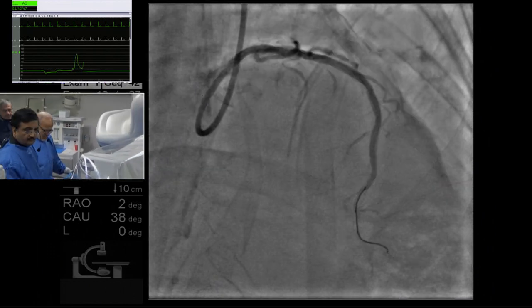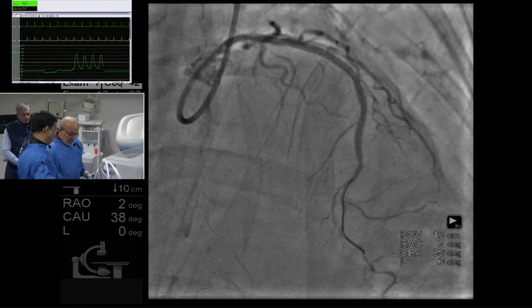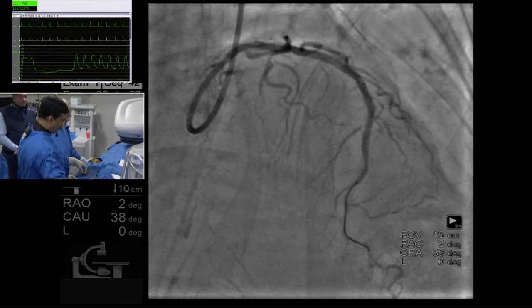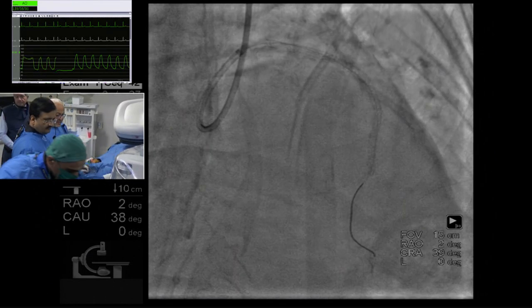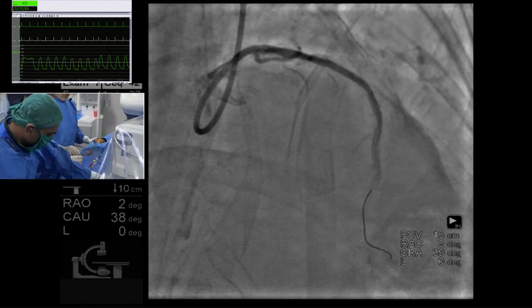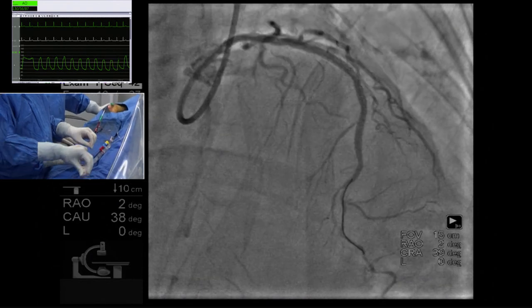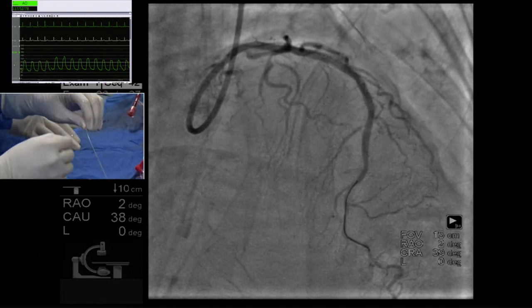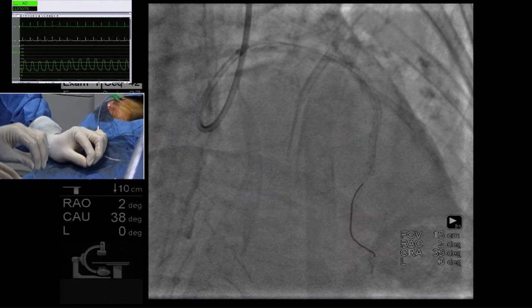Usually the side branch gets preserved. Yeah. In Miami, that's our default stand. I think Samir has a different experience. Samir, if he can stand up and speak about his experience, because I also had the same impression as of now. So it is always important to discuss the property of the product.